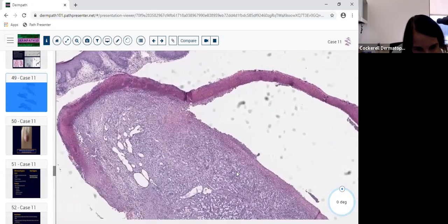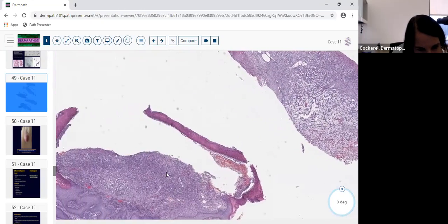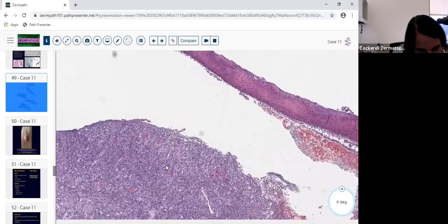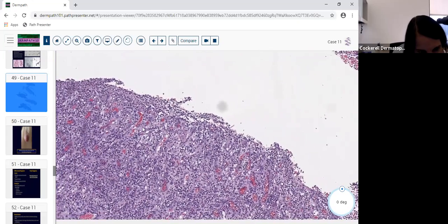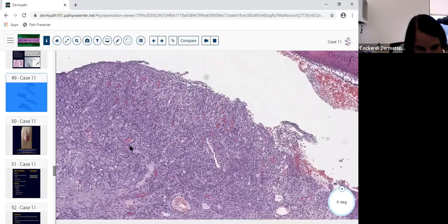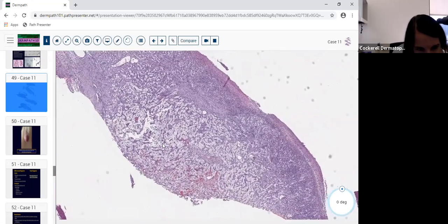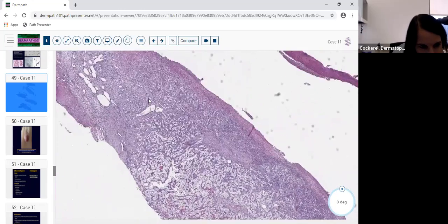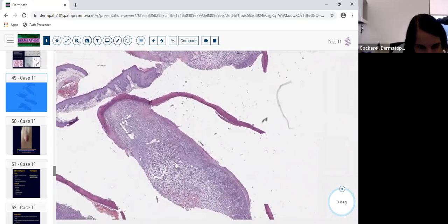And then I wondered, is this ulceration of this tumor, or is this part of the tumor itself? And I believe this is part of the tumor itself. It is an ulcerated surface, but yet there are some clear cells intermixed in here with the inflammation. But thank goodness we have the other area here that's more of a sheet of these clear cells. So some of you are thinking about, well, maybe this is a metastasis, and you're definitely on the right track.